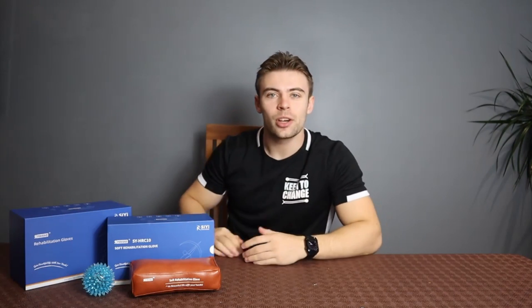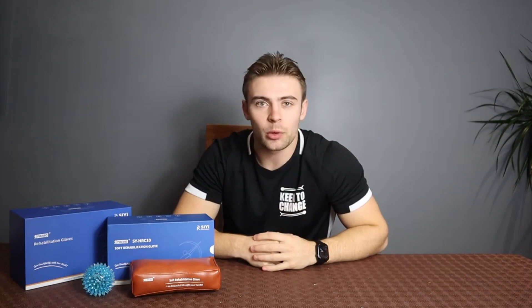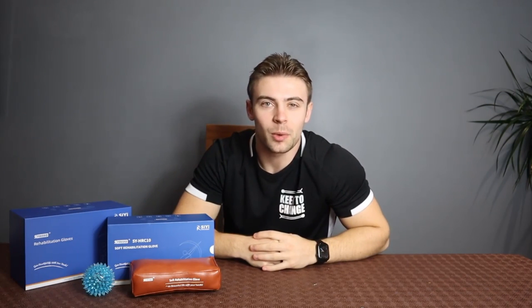Hello everyone. At Keen to Change I've recently collaborated with Syrebo, who have sent me one of their great rehabilitation gloves. Today we're going to have a quick unboxing of what we've got inside here, and we'll give you a quick showcase of what the glove actually does later on in the video.